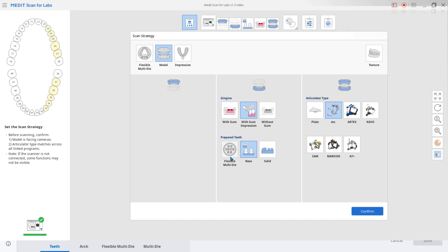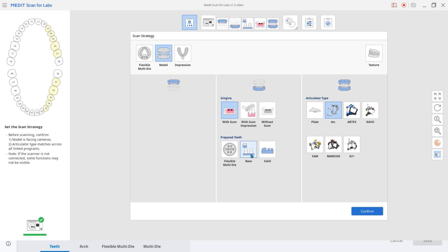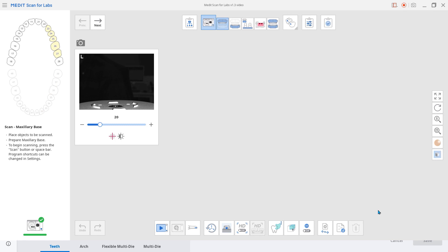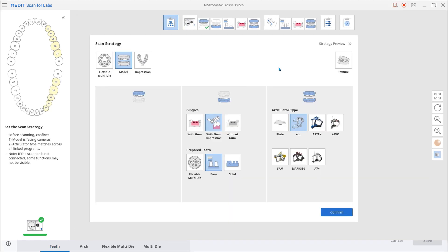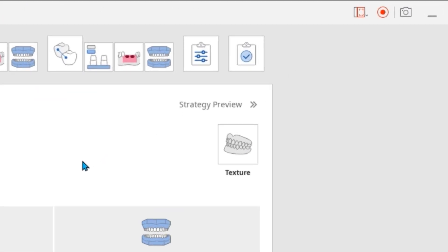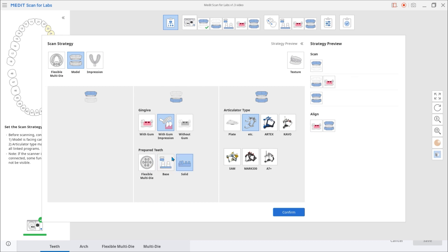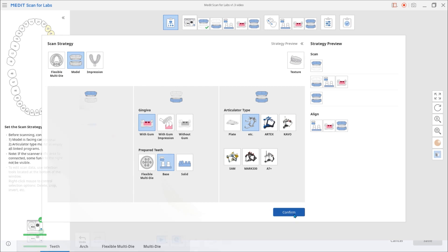Previously, users couldn't see what scan stages are included in each scan strategy unless it was selected, and the scan stages would appear on the top of the screen. In the updated version, using the SlideOut Strategy Preview Sheet, users can check in advance what stages are included in each scan strategy and select accordingly.